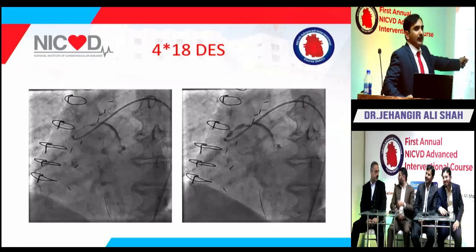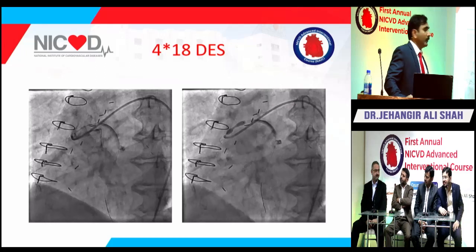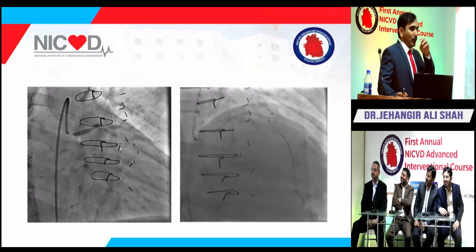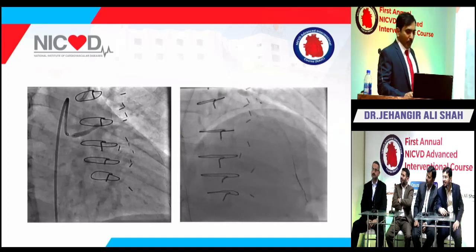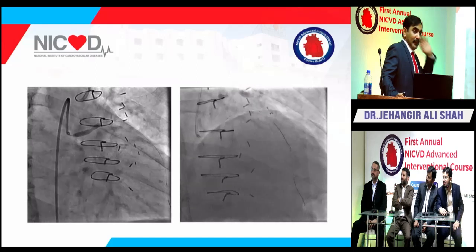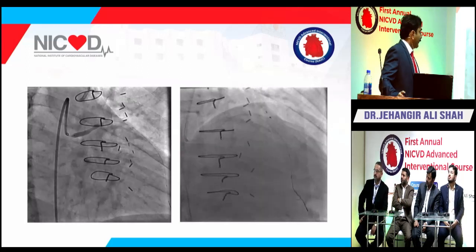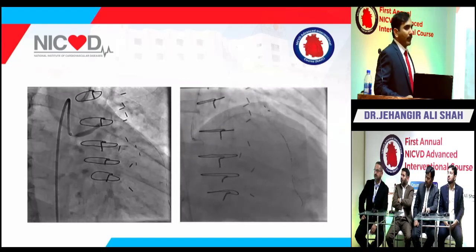To me, that was the view I found best to see those. Okay, let's see what you get. So I start and slowly inflate the stent, and initially you can see in the previous angiogram there was a clear waist in the mid of the stent. This is the point where I have inflated at 16-18 atmospheres, but there was a waist. So I stop here and just pull back my balloon.